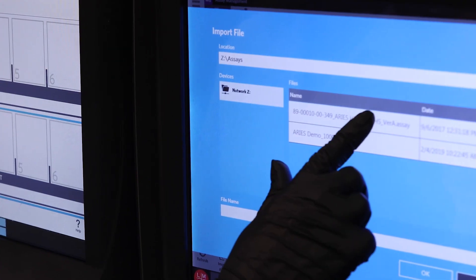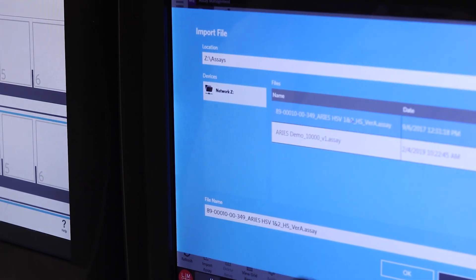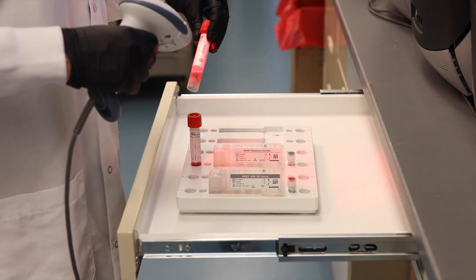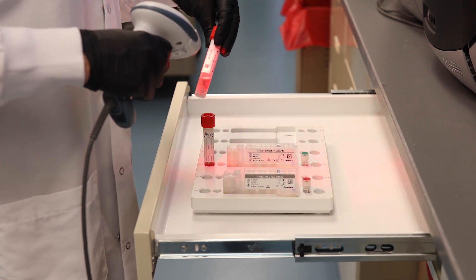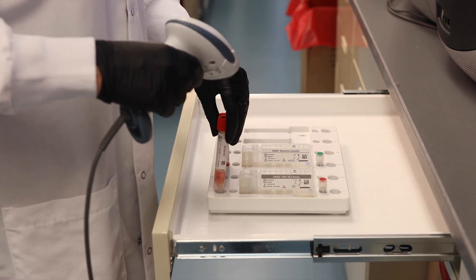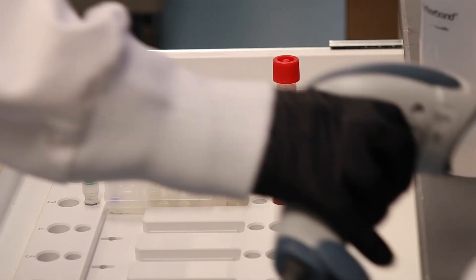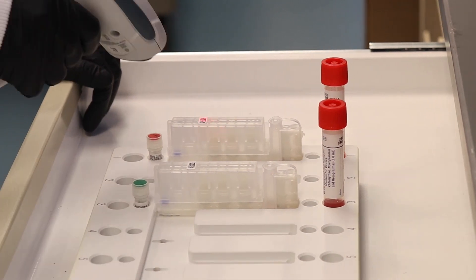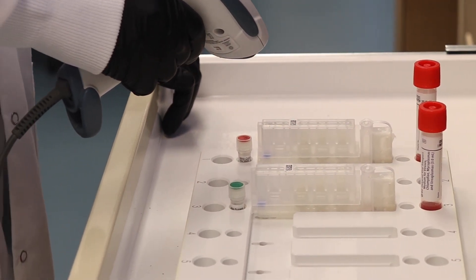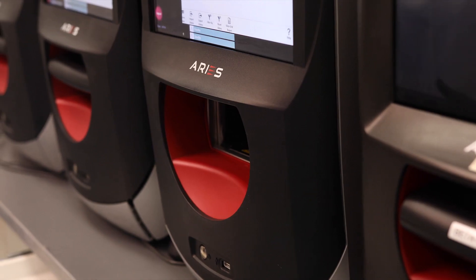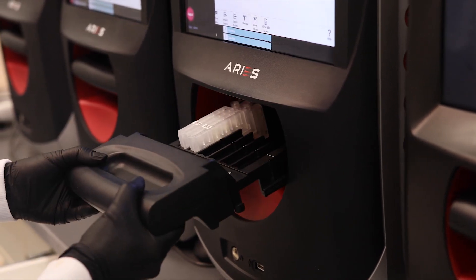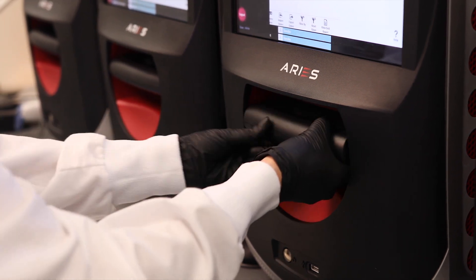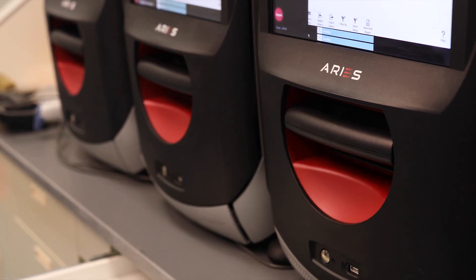On the Ares system or within synced software, you can create orders for each sample. Scan the cassettes and sample barcodes to automatically accession the sample ID and cassette lot information. Now place the magazine into the system and initiate the run.